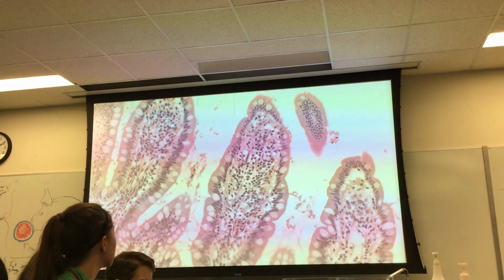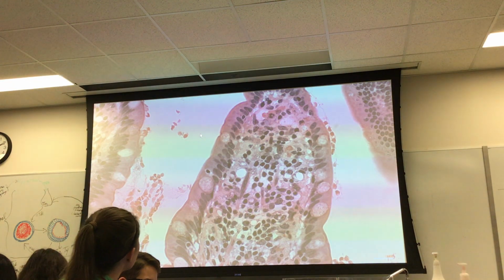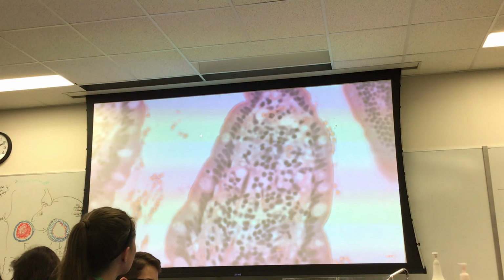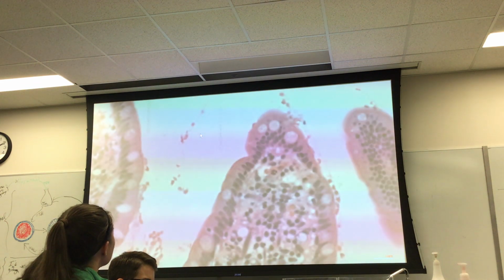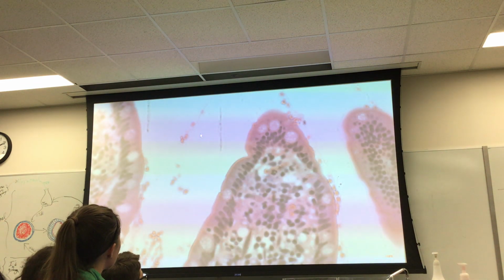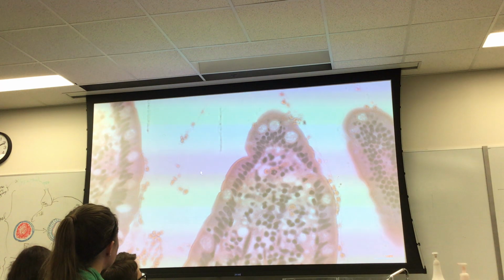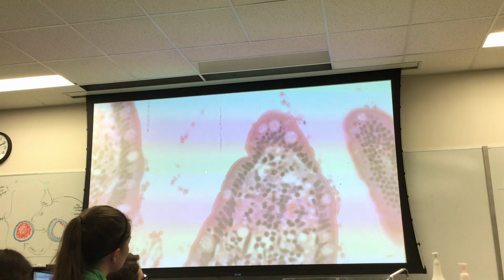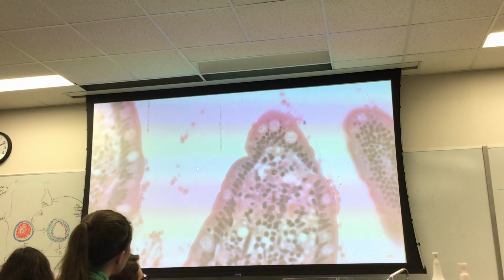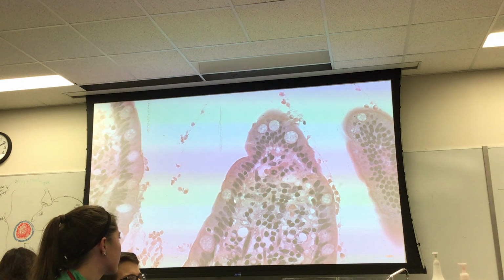Now, in this case, here's my first question, and that is, let's go to higher mag. What is the name of this tissue? Hang on just a second. So here's the lumen. So what's the name of this tissue? So it's a lumen, right? So it's got to be an epithelium. So I think we're getting pretty good at this. Oh, but I see goblet cells. Is that pseudostratified?